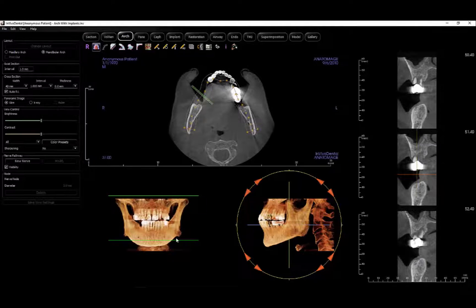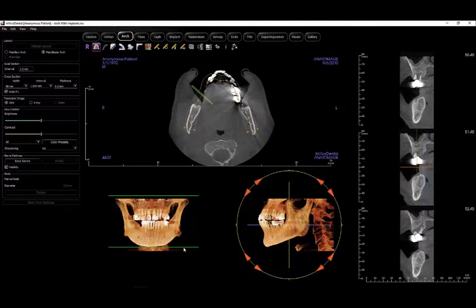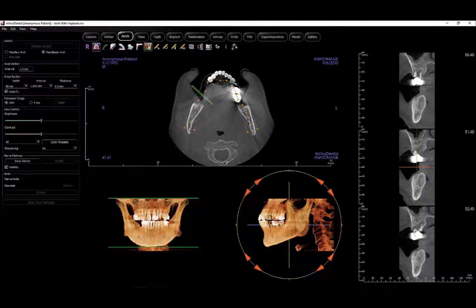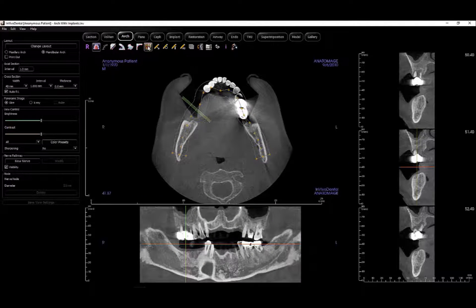Next, adjust the capture area using the green lines to ensure that the full mandible up to the TMJ is included. Once you have finished with the adjustments, click on the tool again to return to the previous window.